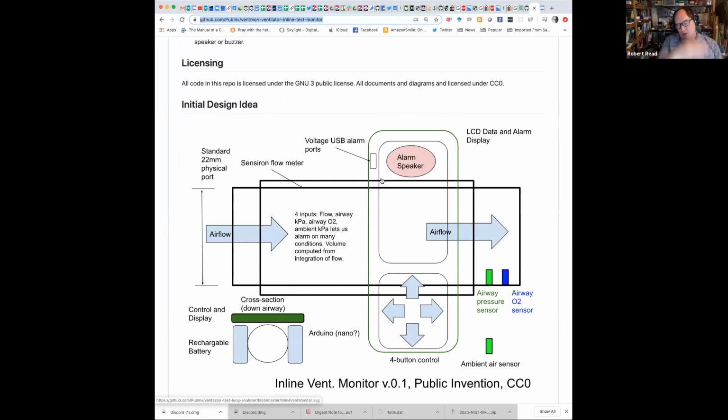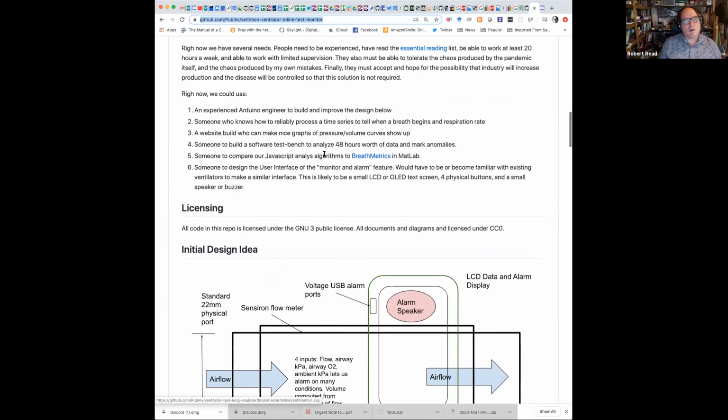The University of Florida system is on my list. It's impossible for me to keep it up to date all the time. With many of these open source projects, the biggest gap is that, frankly, they haven't thought about testing, but they also haven't developed to the point of doing testing and doing reliability testing. Now, the University of Florida system sounds like they've been doing at least some testing.